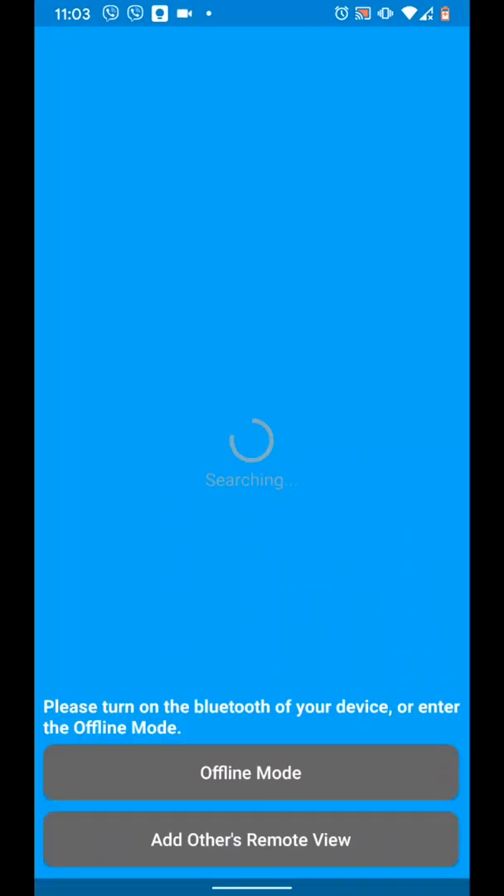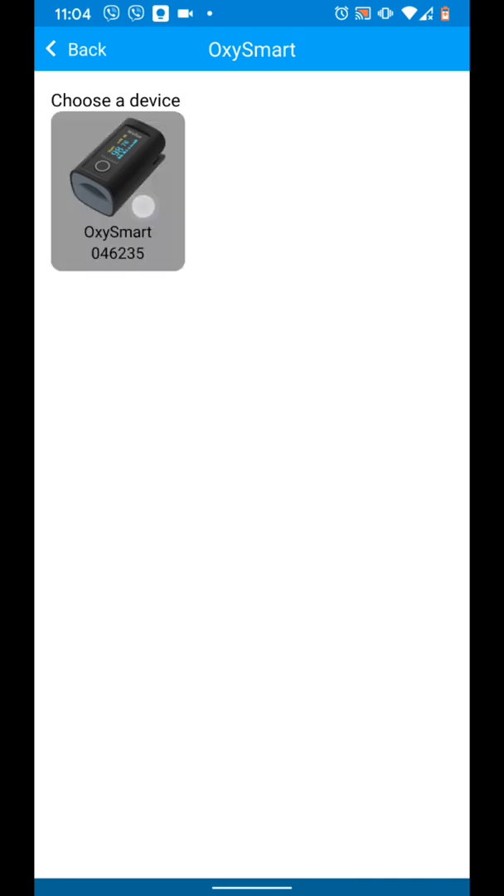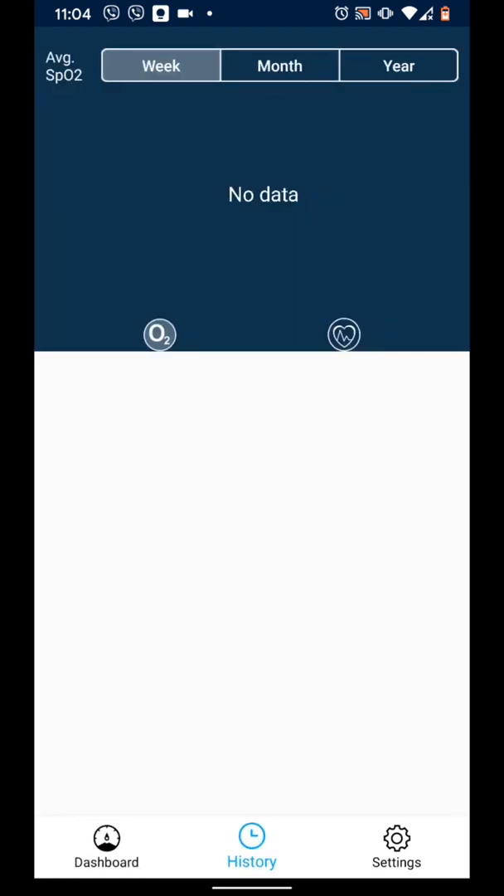Now insert your finger into the oximeter to turn it on. Your oximeter will be discovered — tap on it and then select it. You can now see your live readings. You can also see the history of your readings.